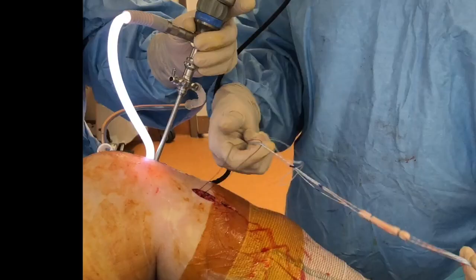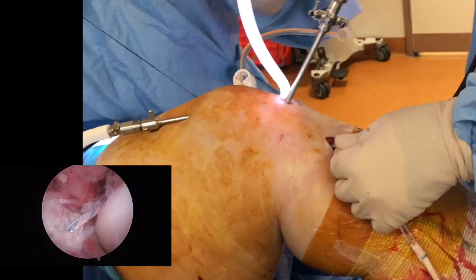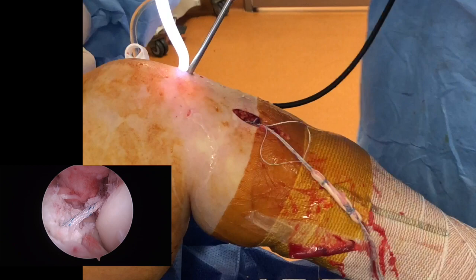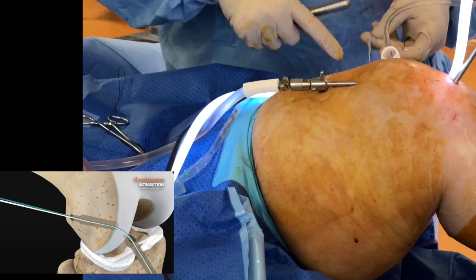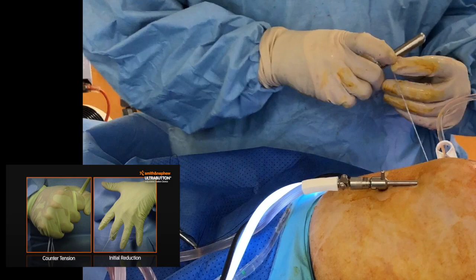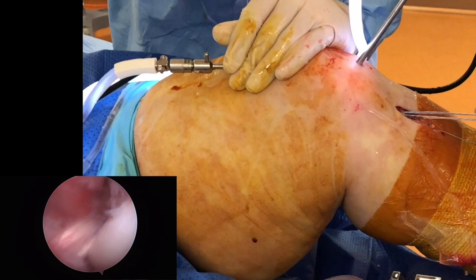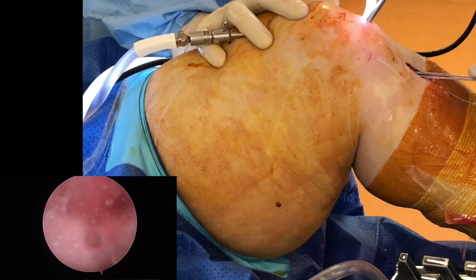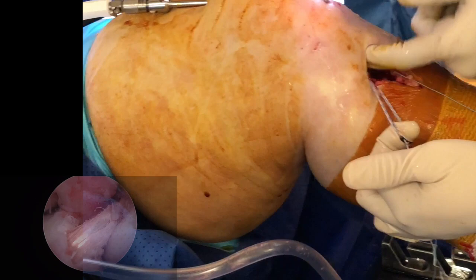We are now going to insert it into the tibia and pull it through. As you can see on the right-hand side, it's gone through and we are now pulling the graft in. Here we are — it's flipped, the button has now flipped. We are now going to pull the ultra-button graft by pulling the ultra-button cord. You can see on screen that the graft has gone through the hole in the tibia, through the joint, and now into the femur.